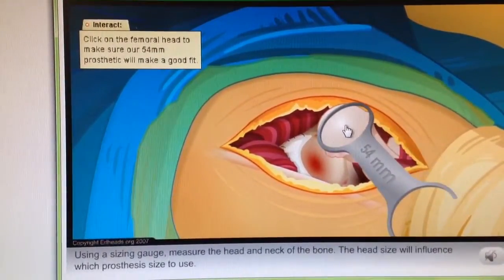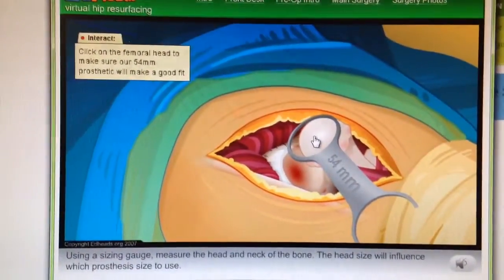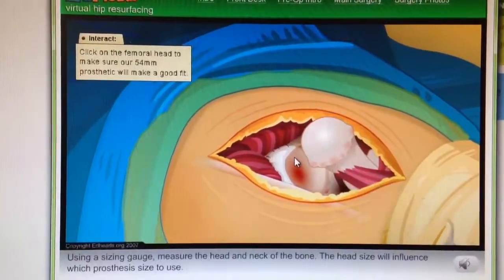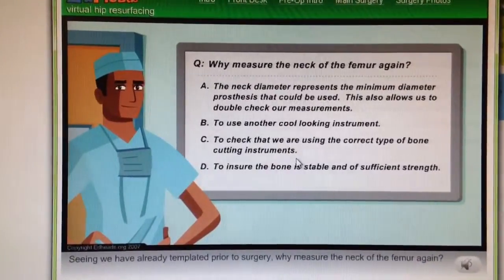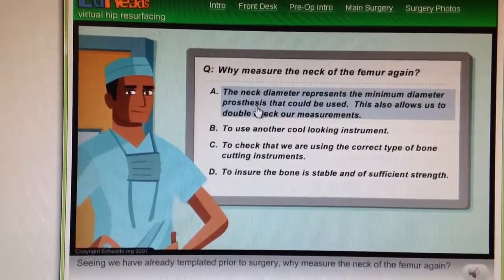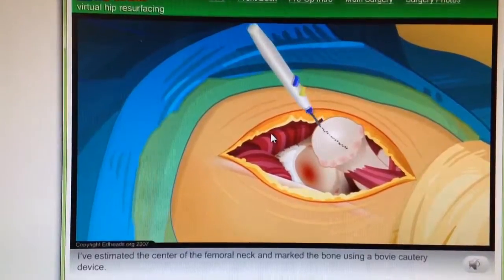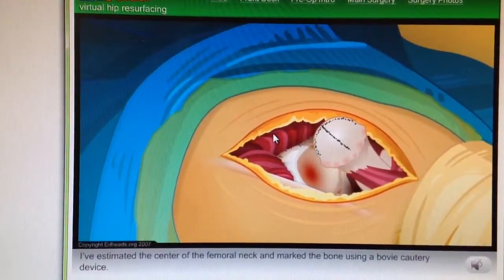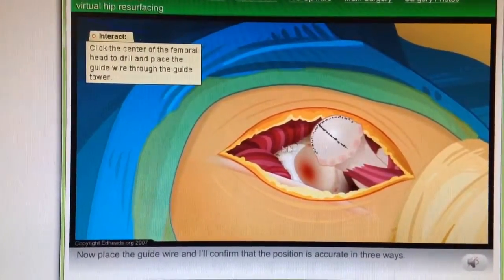Using a sizing gauge, measure the head and neck of the bone. The head size will influence which prosthesis size to use. Seeing we have already templated prior to surgery, why measure the neck of the femur again? Nice job. I've estimated the center of the femoral neck and marked the bone using a bovie cautery device. Now place the guide wire and I'll confirm that the position is accurate in three ways.